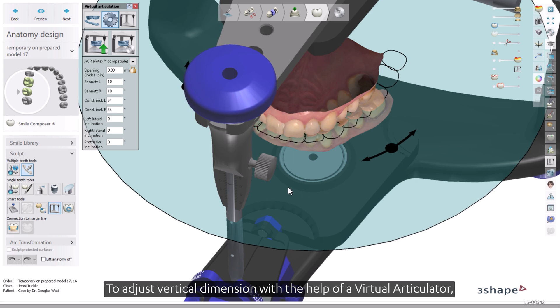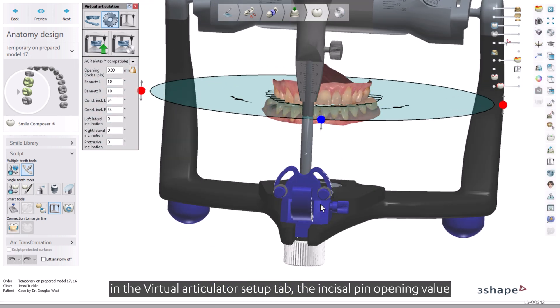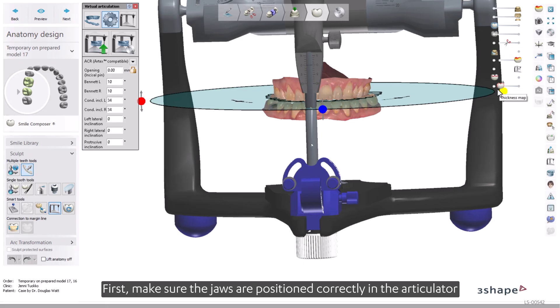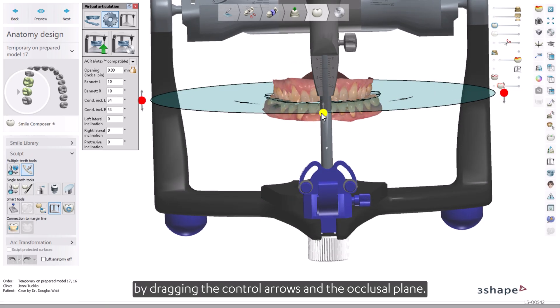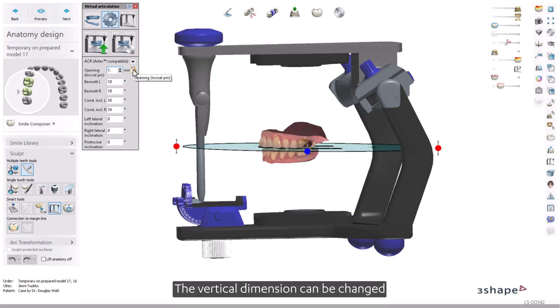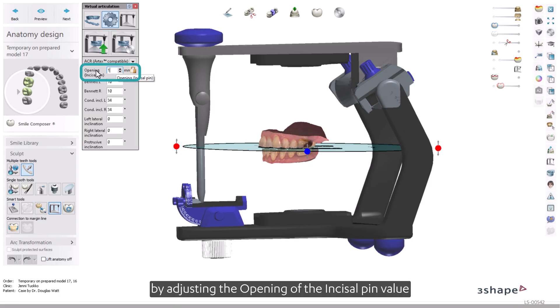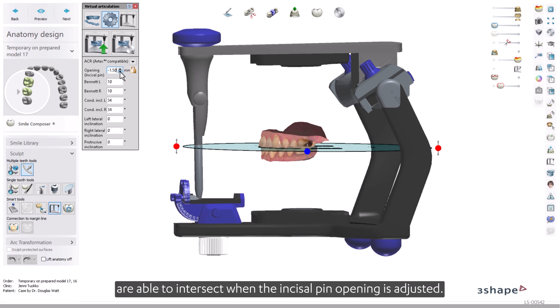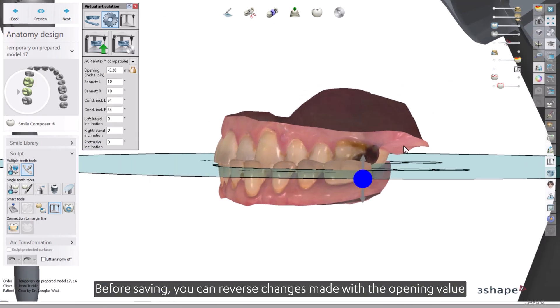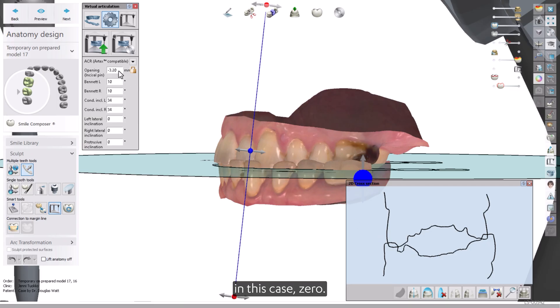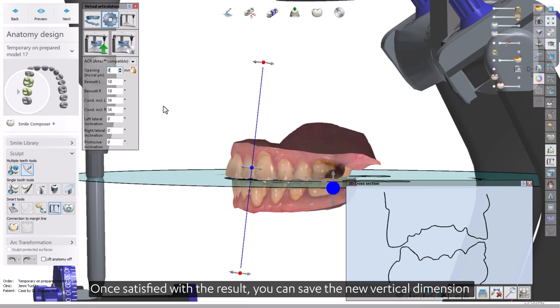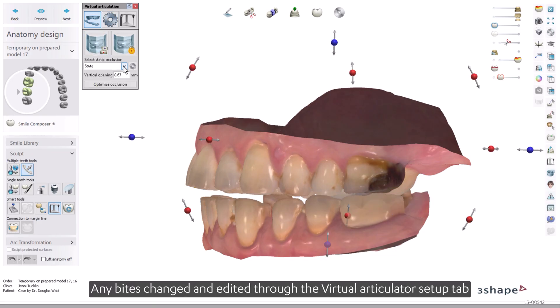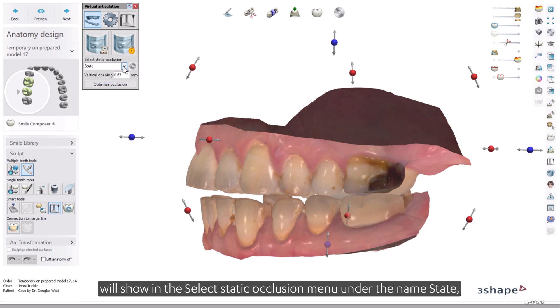To adjust vertical dimension with the help of a virtual articulator, in the Virtual Articulator Setup tab, the incisal pin opening value can be used for managing the vertical dimension. First, make sure the jaws are positioned correctly in the articulator by dragging the control arrows and the occlusal plane. You can also change the articulator type if needed. The vertical dimension can be changed by adjusting the opening of the incisal pin value according to the treatment plan. Note that the upper and lower jaw scans are able to intersect when the incisal pin opening is adjusted. Before saving, you can reverse changes by inserting the original opening value — in this case, zero. Once satisfied, save the new vertical dimension by selecting Lock Current Alignment of the Jaws. Any bites changed through the Virtual Articulator Setup tab will show in the Select Static Occlusion menu under the name State with a running number.